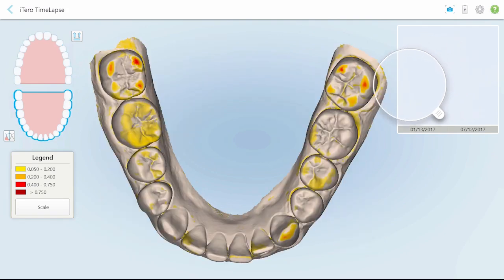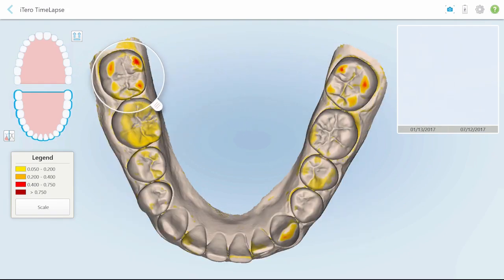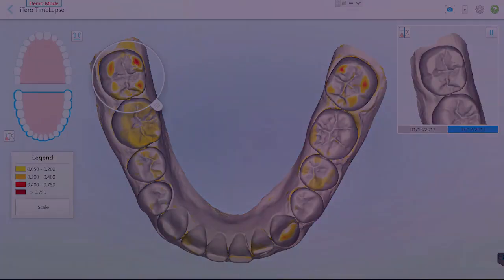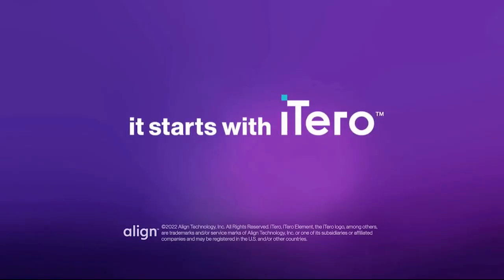Intraoral areas of interest can be magnified and animated to demonstrate the difference between the selected scans. In addition, the different viewing options will emphasize different conditions. It starts with iTero.